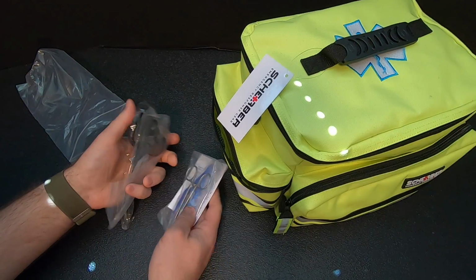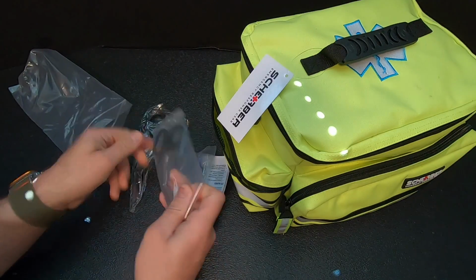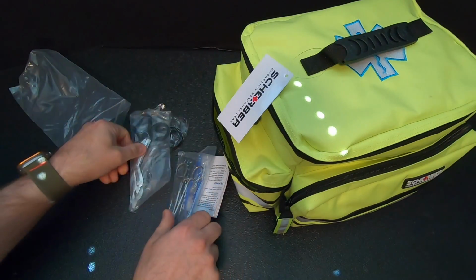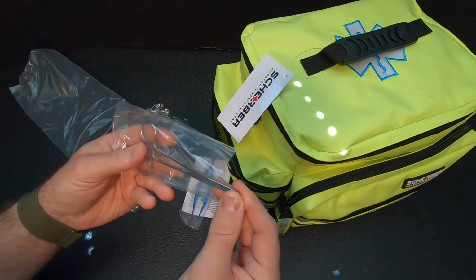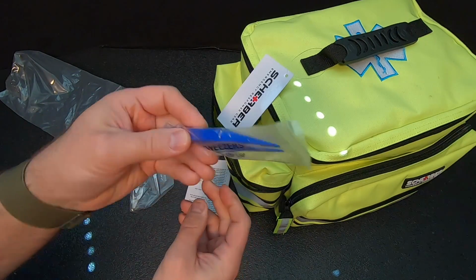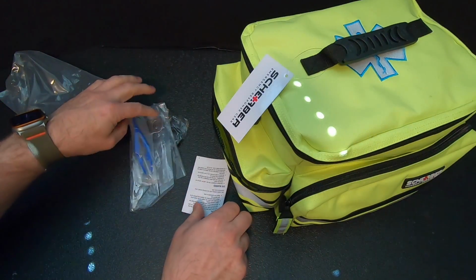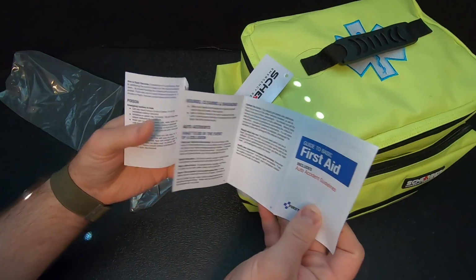So here we've got some cutting stuff. We've got a large shears. We've got a small shears. We've got a forceps, or what do you call that? A hemostat or forceps with the little alligator thing. And we've got a set of plastic tweezers. And then we've got a basic guide for first aid.